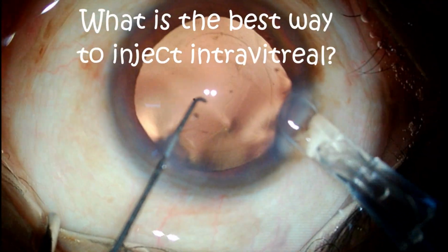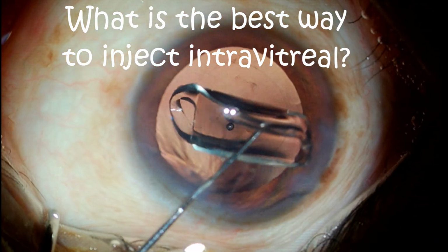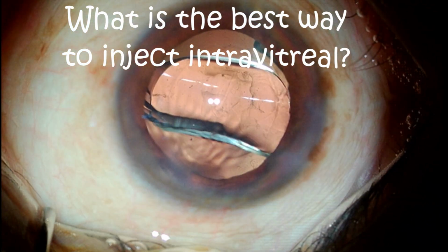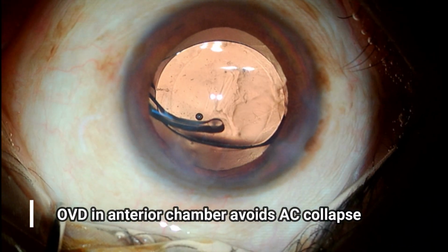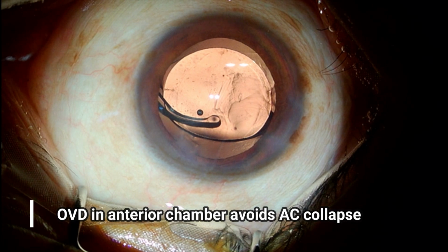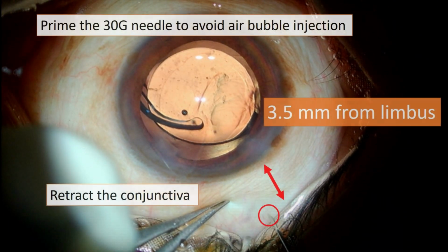Now what is the best way to inject the intravitreal injection when we are doing it along with the phaco procedure? So best timing is when you have already implanted the IOL and there is an OVD which is already filling the anterior chamber, which avoids collapse of the anterior chamber when the intravitreal is given. Intravitreal is given at 3.5 mm from the limbus. Retract the conjunctiva a little bit. Prime the 30 gauge needle with the intravitreal injection so as to avoid any air bubble injection which may give rise to floater or bubble inside.